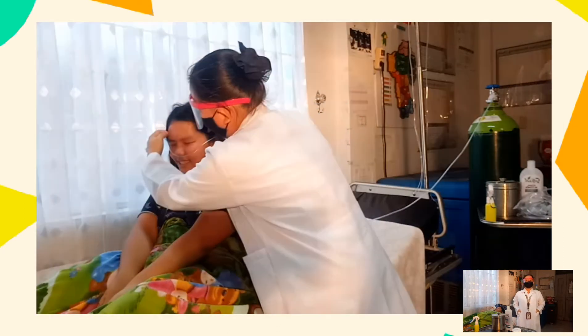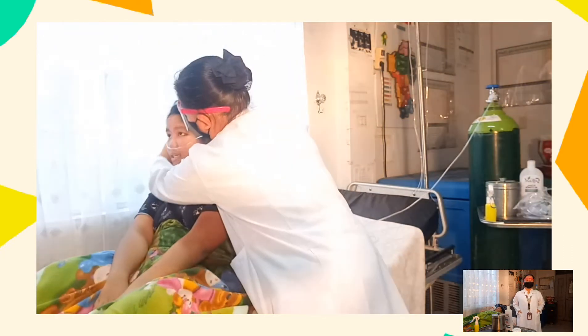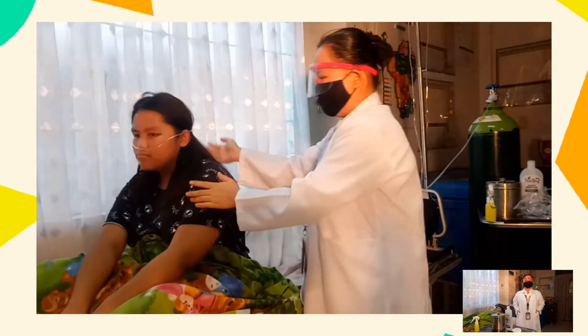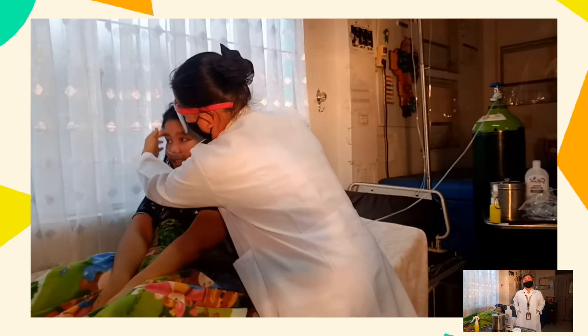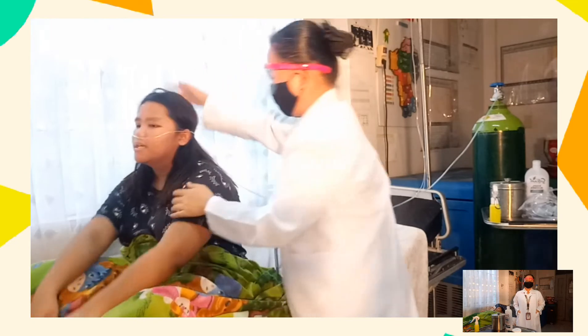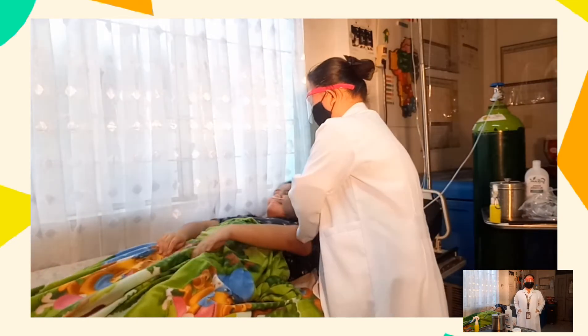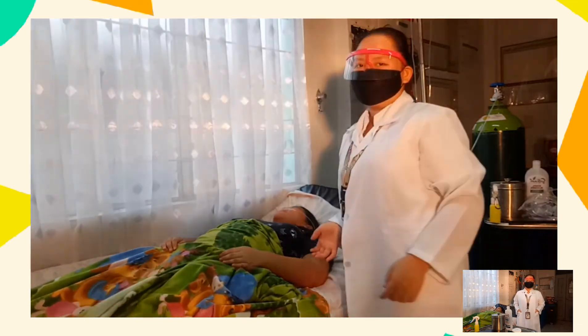Next, adjust the fit of the cannula as necessary. The tubing should be snug but not tight against the skin. Encourage the patient to breathe through the nose with the mouth closed.